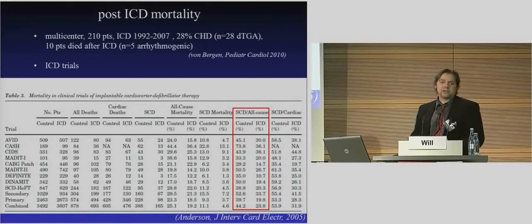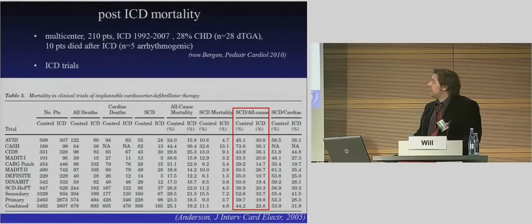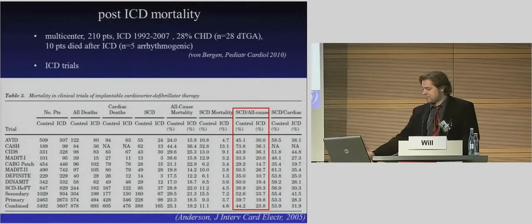One thing we actually have to worry about, and this is what we have to know, and I think what we have to tell the families and the patients, is that if you look at the post-ICD mortality, this is not zero. And this is somehow the way that it just reduces the risk of sudden death by about 50%. And this is something which we know also from the AICD trials from the adult world, that if you look at the possibility to die and sudden cardiac death in relation to all causes that you can die, the ICD group here is only about half the numbers than the control. But this is definitely not zero, and this has been shown also here in this pediatric group, where 5 patients died of arrhythmia after the ICD implantation.